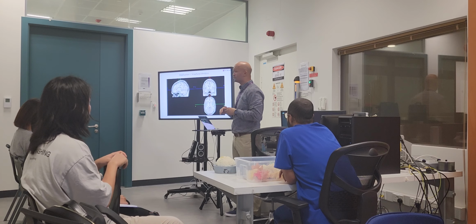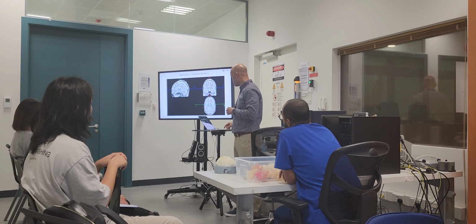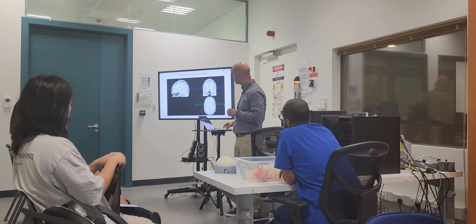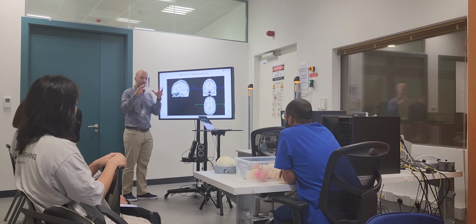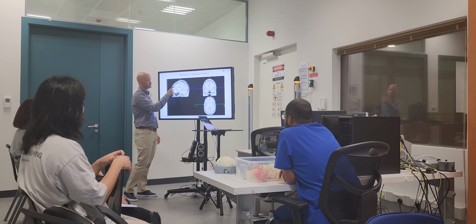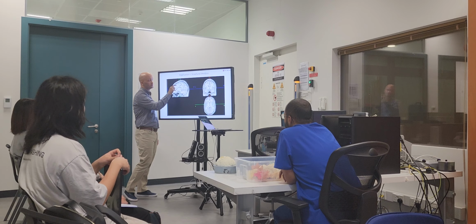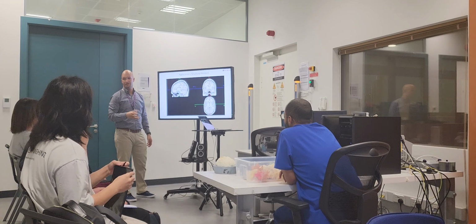So this is what we call a T1 weighted image. This is what we call a T2 weighted image. What do you think about the difference between them? Contrast. Yeah. So remember when I showed you the side of my brain that is smaller, it's the white matter here. On top of it, you see this ribbon? This is the cortical surface. This is where the action happens.